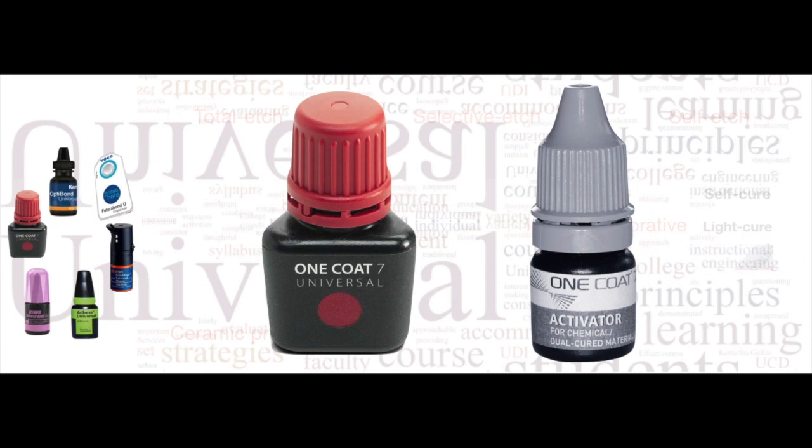So the question now is, what to do when your universal adhesive has a pH lower than 3? We are going to use as an example the 1-Coat7 universal adhesive from Coltene. It is important to understand that if you were to use this adhesive in combination with a dual cure resin cement like DuoCem, you would need to add the 1-Coat activator to your protocol. What the activator does is increase the pH of the adhesive layer, allowing proper dual curing polymerization of the resin cement.